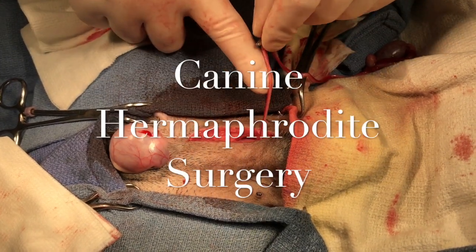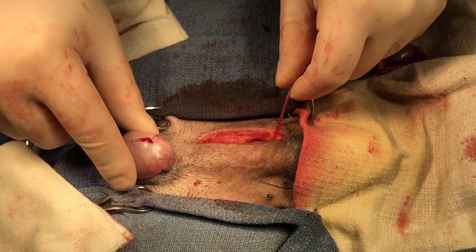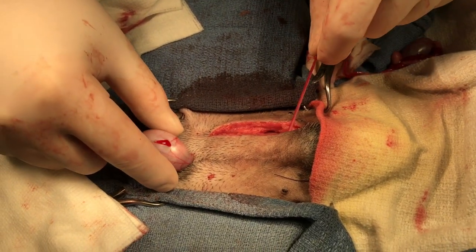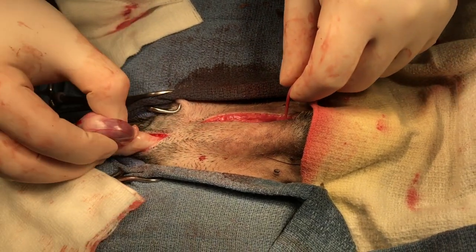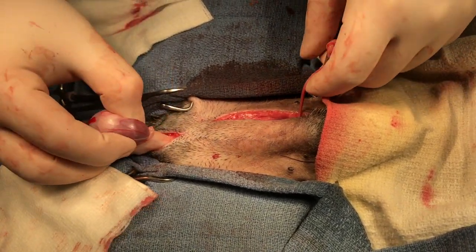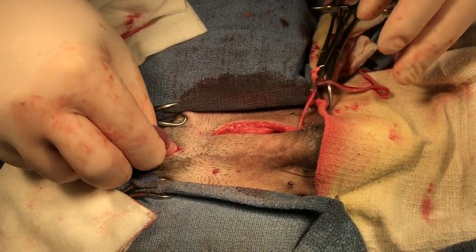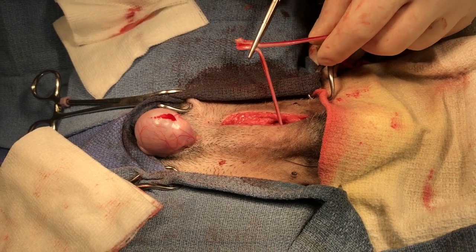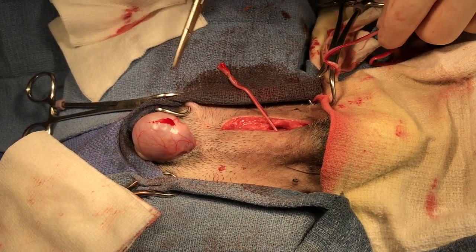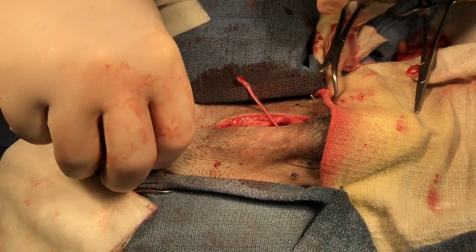Here is a uterine horn, and if you look over at the scrotum, it's attached to the testicle. Now we are going to remove this uterine horn by way of the scrotum.